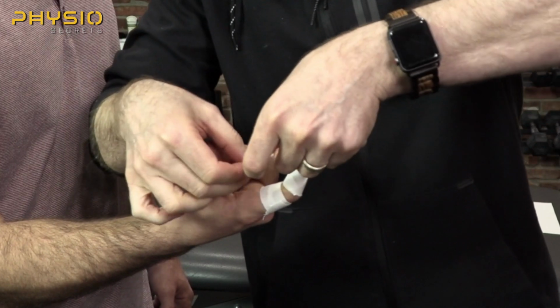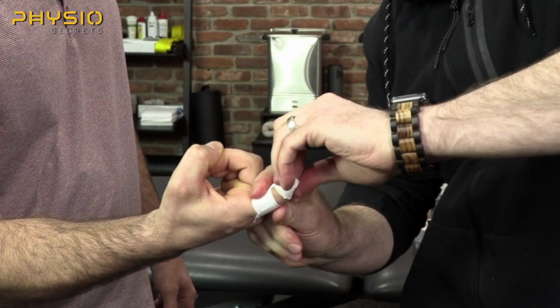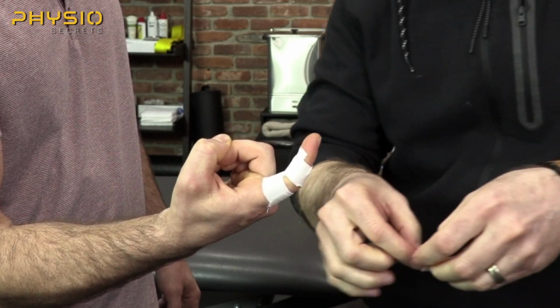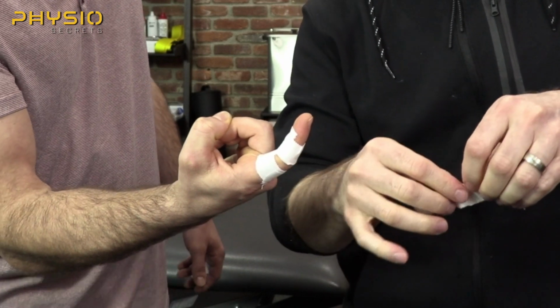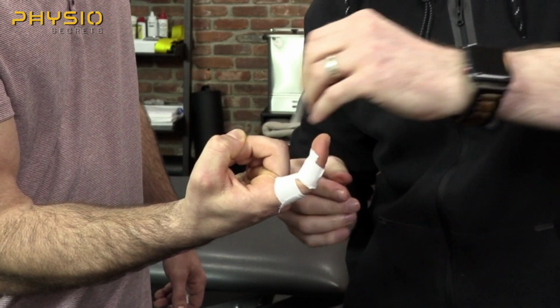And then I'm going to apply the tape across my 2 anchor points. Boom, boom. Right there, and get it nice and taut. Now, given that this tape is not the best tape in the world, I would really do this with Leuko tape, but because I can't tear Leuko tape, I can only cut it, I'm using athletic tape just to show you guys.